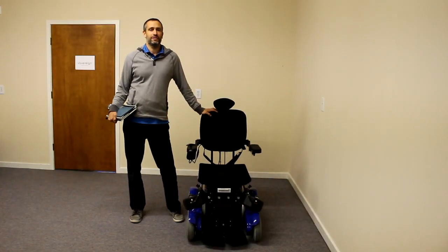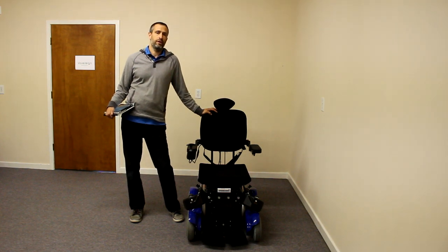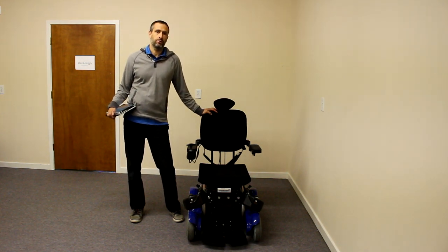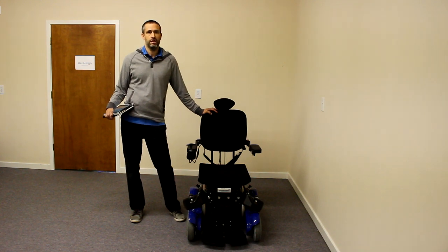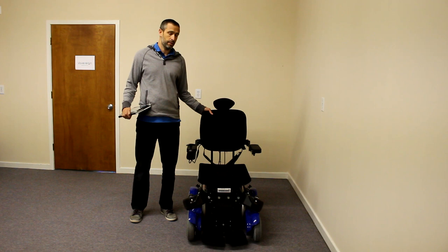Hello, everyone. My name is Dana Mazur with Sauber Medical Supply in Wilmington, North Carolina. I'm back with another wheelchair review for you. Today we're doing the Levo C3 Power Standing Wheelchair — a pretty exciting product.